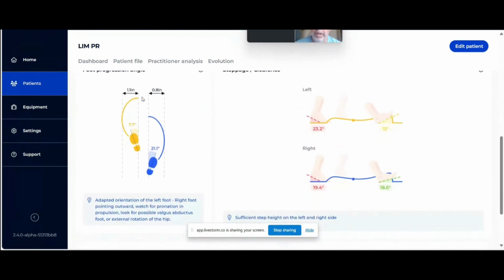Pretty normal with regards to circumduction, but again, she's not really moving that much. And so if they don't have, as we talked about earlier, good plantar flexion and dorsiflexion, then they're not going to be able to lift their feet if they're really weak in the hip flexors. And so they just kind of scuff along, right? And so we do see that here where we have very low angles on toe off, which again builds my assumption of what's going on with this person.